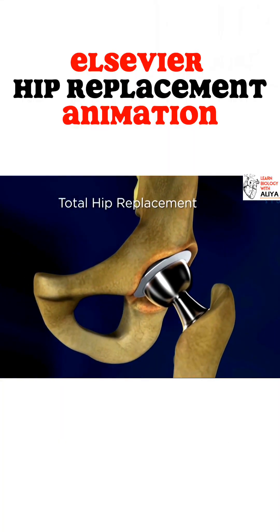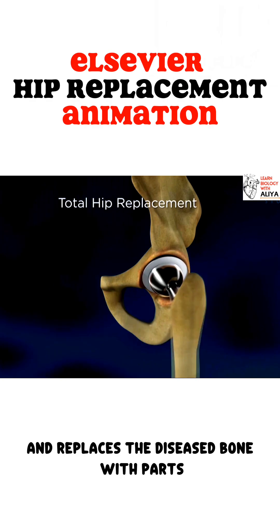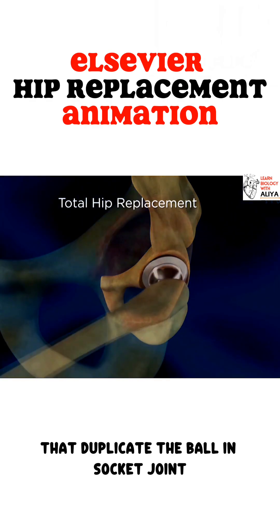A total hip replacement operation removes the damaged portions of the bone and replaces the diseased bone with parts that duplicate the ball and socket joint.